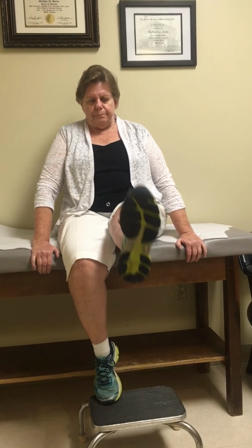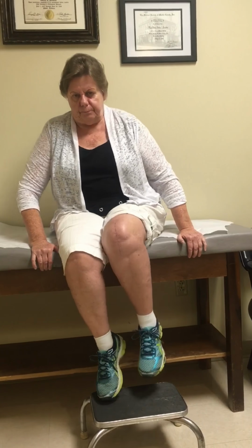A lot of the things that we think about with that portion of the joint have to do with stair climbing and getting up and down from a low chair, and that can be painful. And we'll try to get some x-rays or other materials together to kind of demonstrate what we're talking about. If you would show us your knee motion now, just straighten and bend a little bit for us. Okay, and obviously that's working well, and decreased pain now that we've resurfaced the patella.